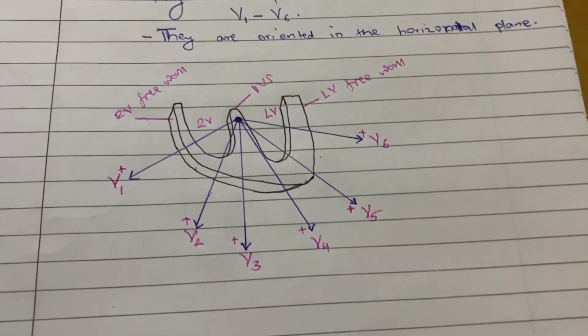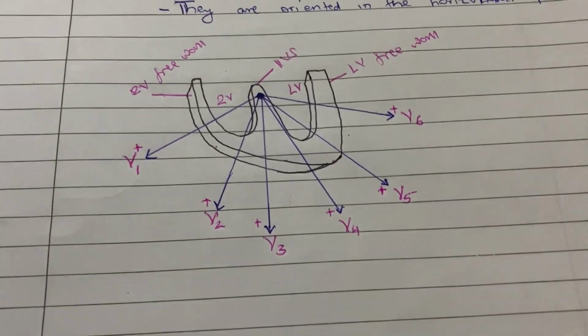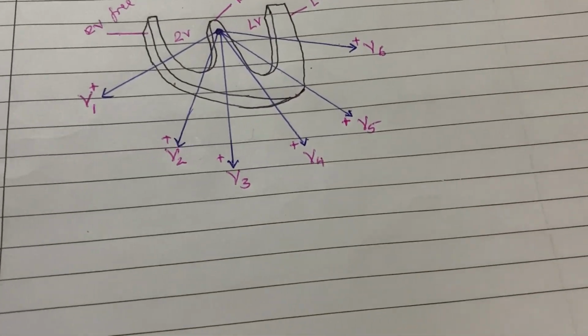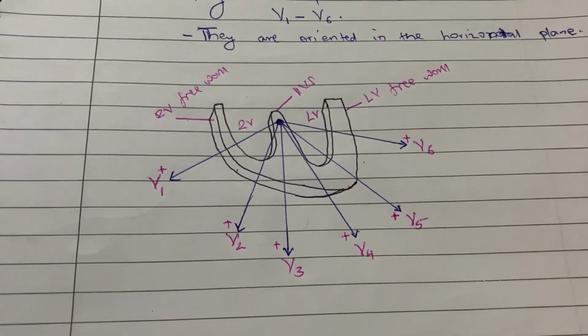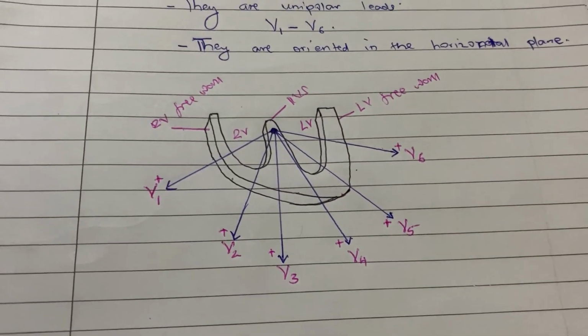And this is how they see the heart. It cuts the heart into the base, where the atria are, and then the ventricles. It cuts in the middle, not in the frontal plane. So the limb leads show from downwards, inferiorly, and then superiorly. But these ones are seeing anteriorly.